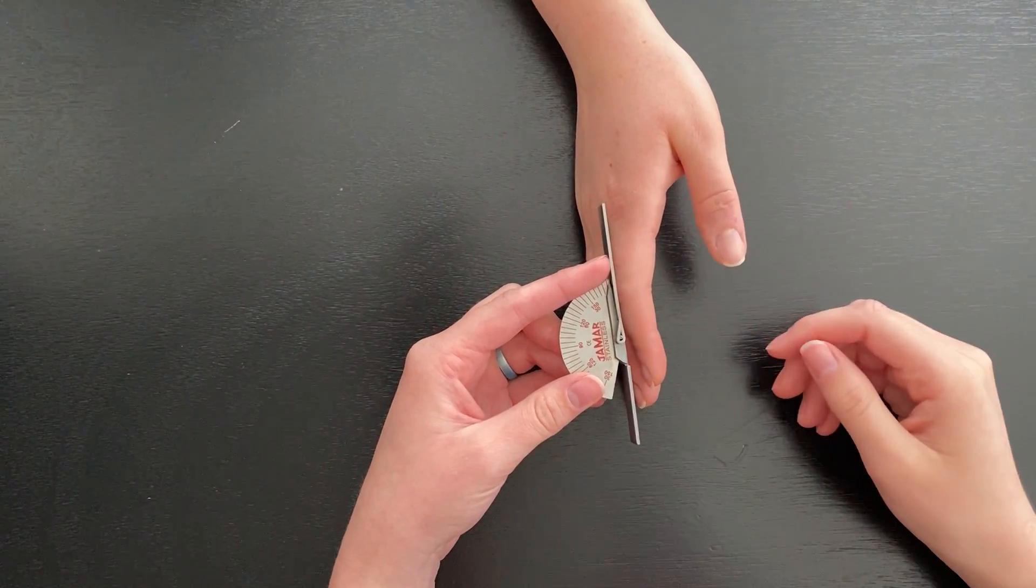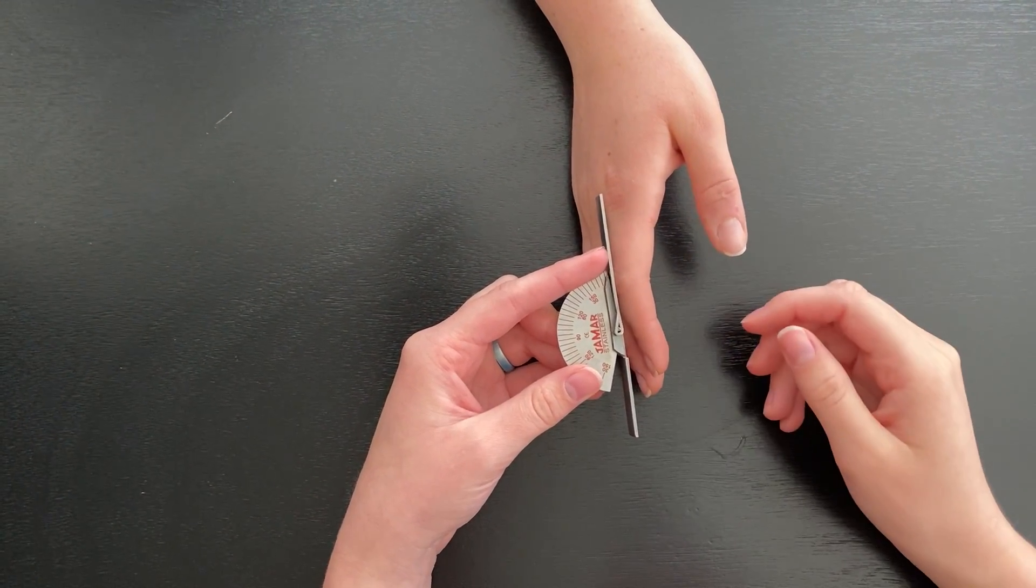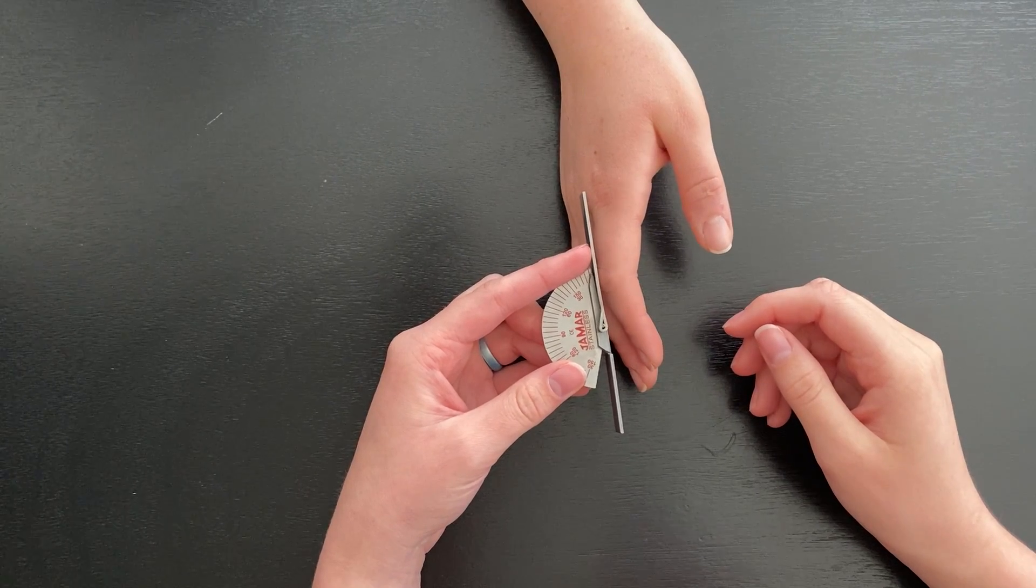All right, this next one is going to be finger DIP flexion. The typical range is 0 to 80 degrees.